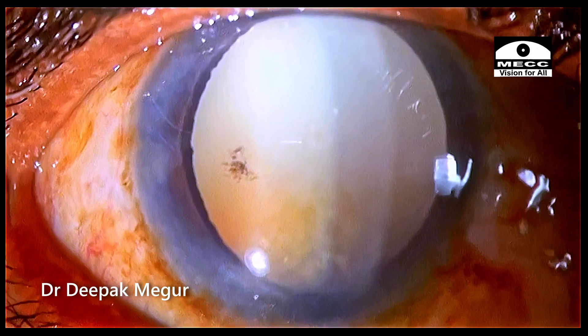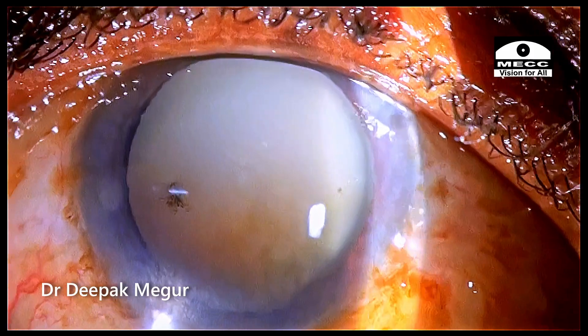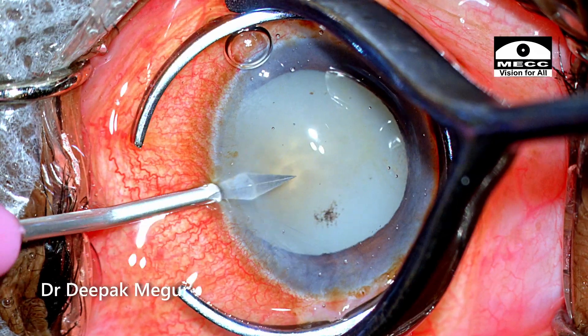Slit lamp examination does not reveal any phacodonesis as such, suggesting that the zonules could be all right. So let's see how things work out with the surgery.